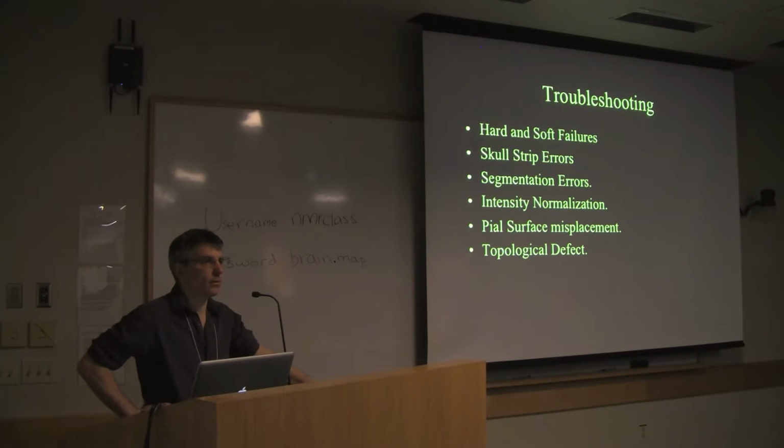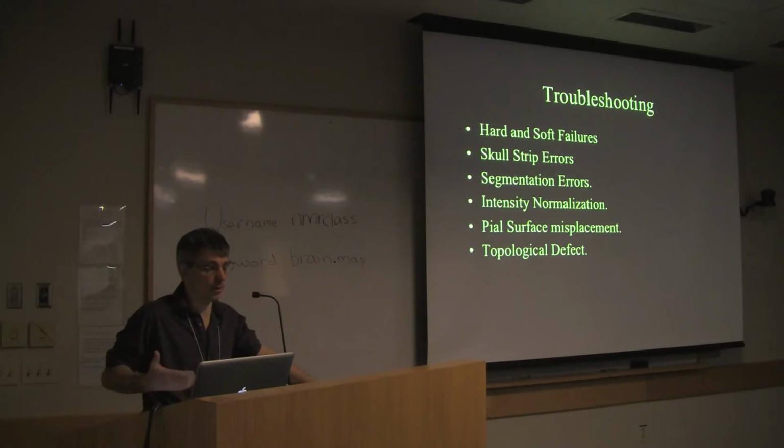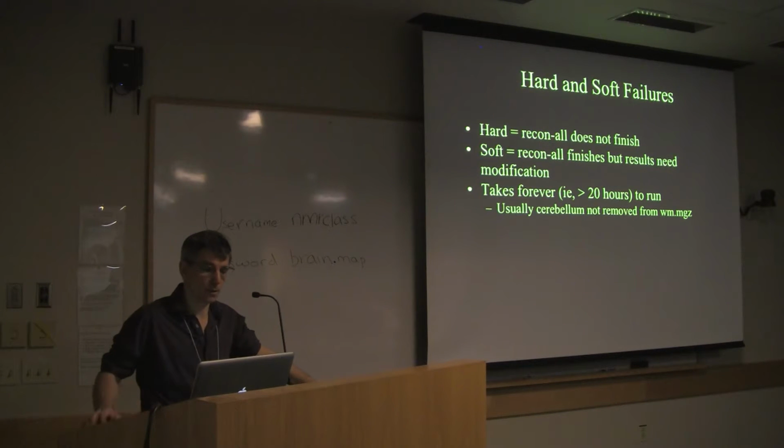And so I should preface this by saying that probably like 90% or so, if you have good quality data, it's often the case that you don't need to do anything to it. But you always should go through and check it because it's hard to tell. You don't know just because recon-all finished whether it did the right thing or not.